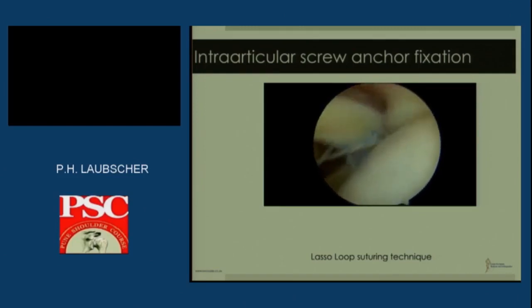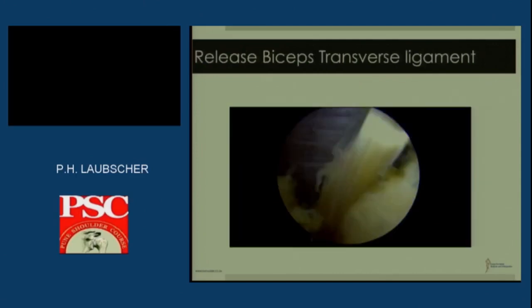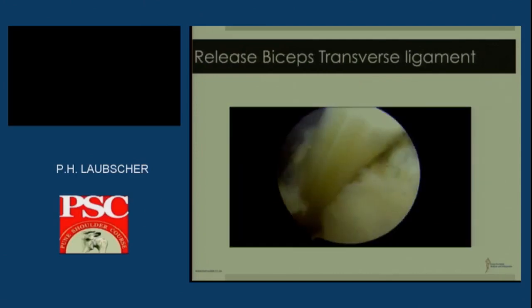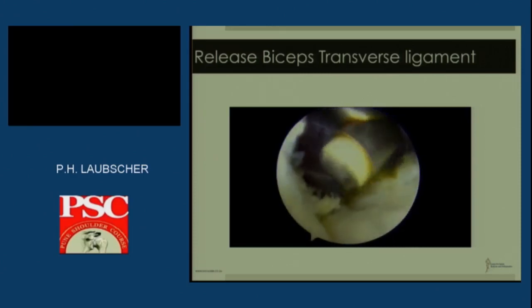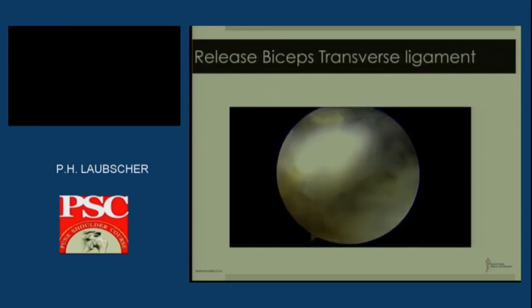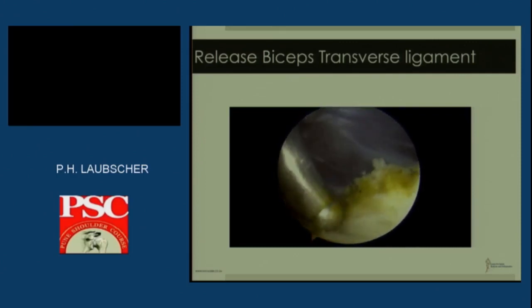And by doing that, I'm able to recreate the tension more accurately. Moving on to a different version. What we are doing here is you've got a left-hand shoulder. The arthroscopy is intra-articular. I've released the transverse ligament.